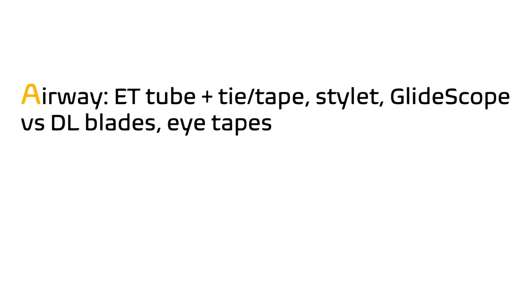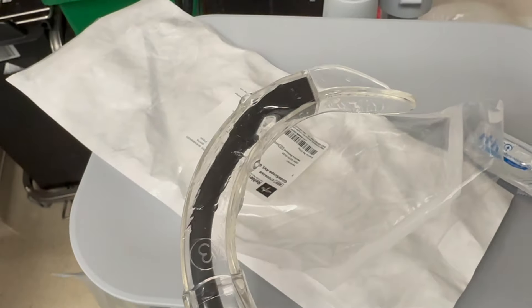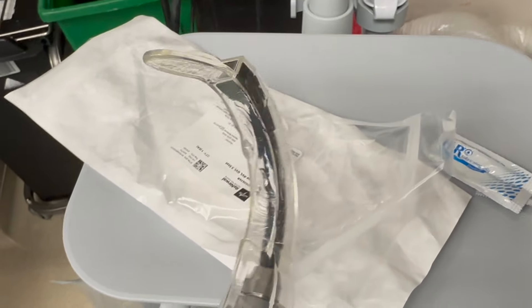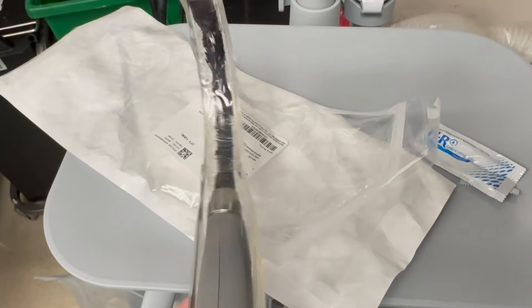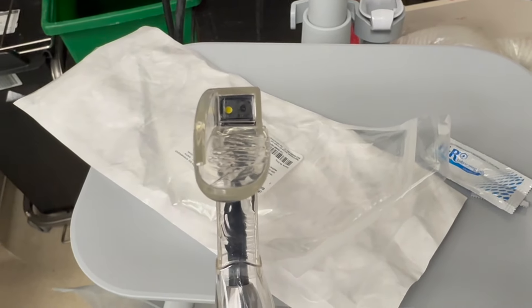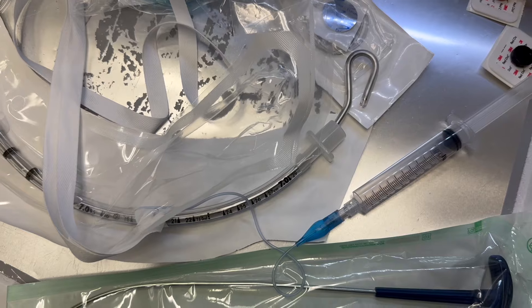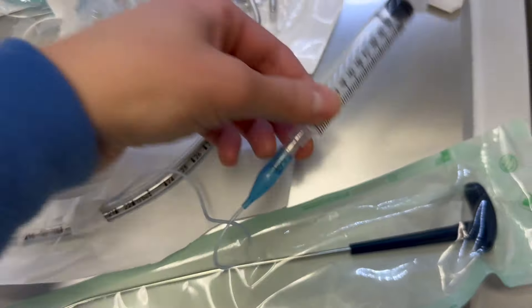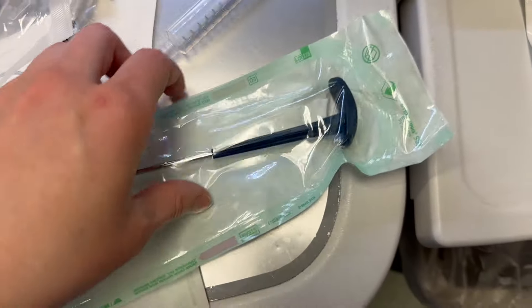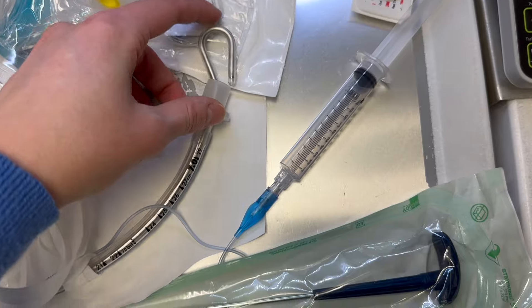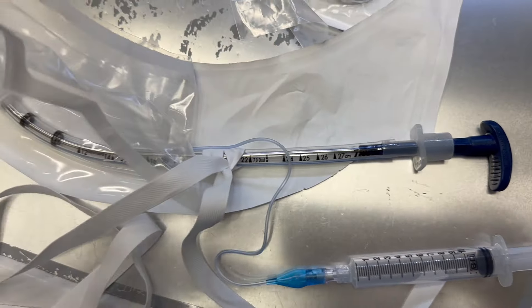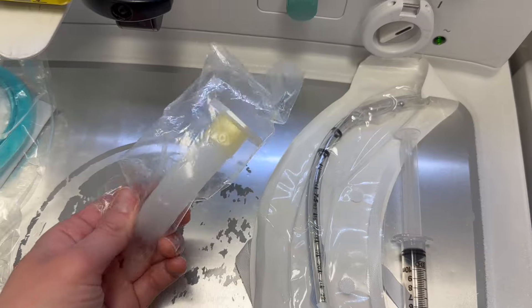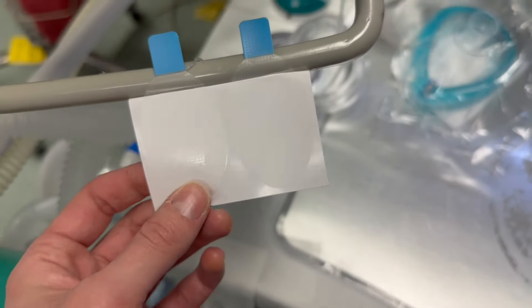Airway is next, which includes your ET tube plus the securing tie or tape, a stylet, a GlideScope or your Mac or Miller blades, as well as the eye tapes you need for intubation. My case is going to be a GlideScope case. I have prepared the GlideScope here by applying a size 3 cover and lubing up the cover, making sure to avoid the camera. I will also make sure to grab a GlideScope stylet. I've chosen a 7.0 tube, applied a tie, and checked the cuff using a 10cc syringe. Here is the GlideScope stylet now in place. I also make sure to have an oral airway out as well as patient eye tapes.